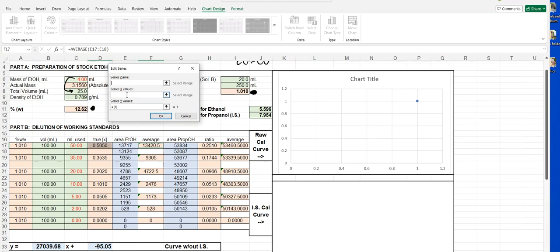So in this box, I'm going to click, and there's my cursor. And these are the X values that I want that graph to plot for me. So using the control button, I'm going to hold it down on the keyboard. I'm going to click 50/50. Notice it went into that cell. 35/35, 20/20, 10/10, 05/05, 02/02, and 0. There we go. So I have chosen the X ordinates that I want plotted on this graph, and I did that individually.